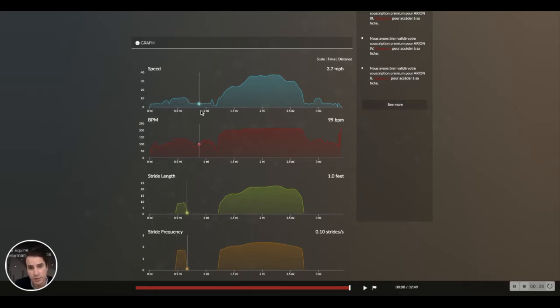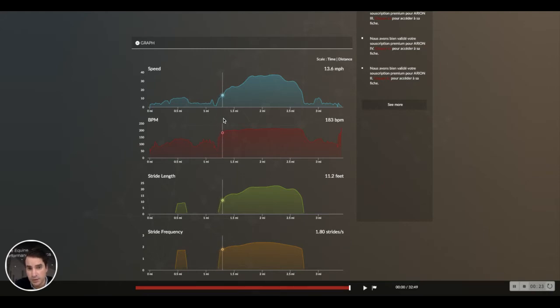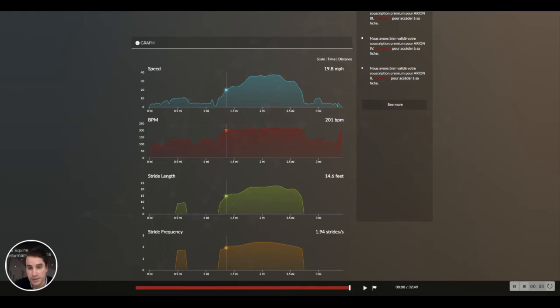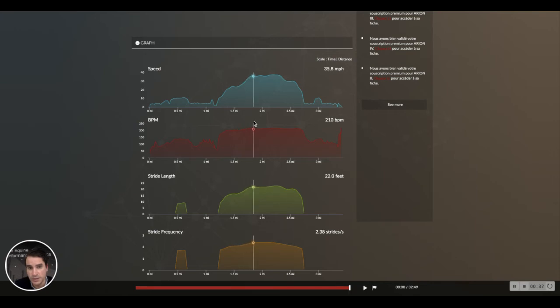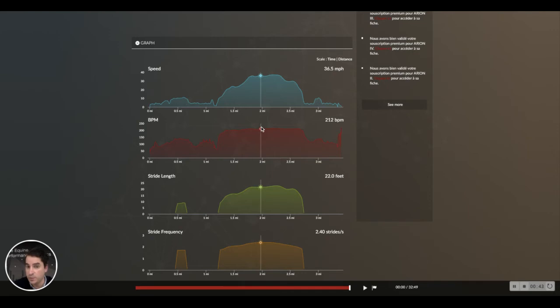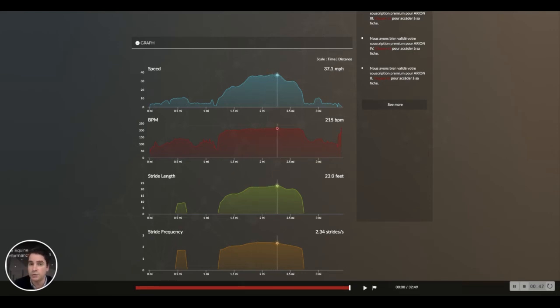Have a look at the heart rate curve during exercise. As you can see, when the horse is only at 19 miles per hour, he's already reaching his maximum heart rate level at 200 beats per minute. Even at 35.5 miles per hour, he's still at about the same heart rate level. This is abnormal - the heart rate should follow the speed curve and not be at maximum at this speed.